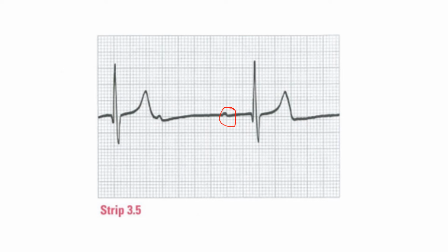So there's two P's for these QRSs, and there are Q waves. The Q wave is the negative deflection, right? And R waves. We have R waves, and then we have S waves. Again, another negative deflection. Your R wave is positive, your S waves are negative, and your Q waves are negative. And you have your T waves. Okay.